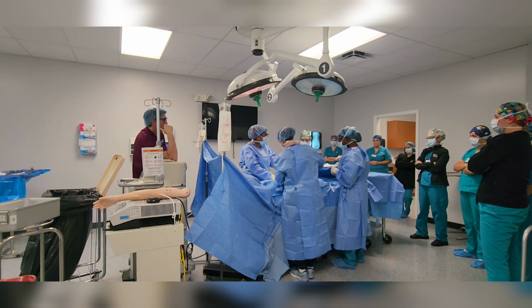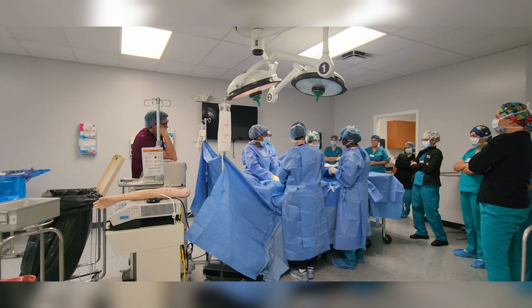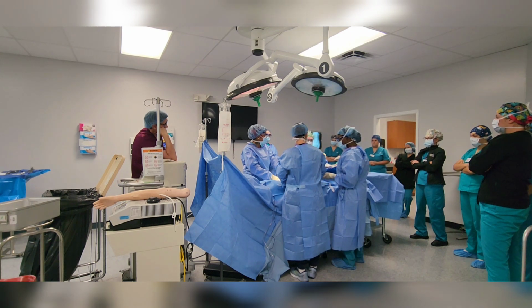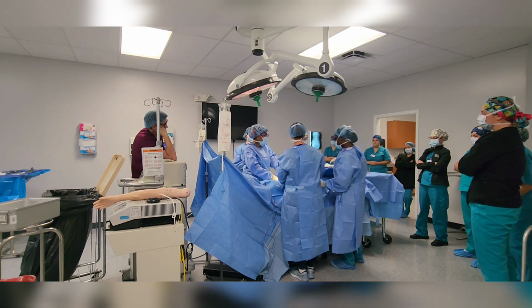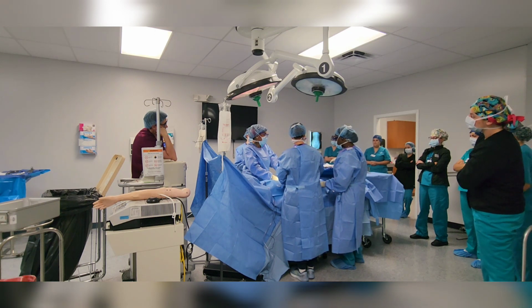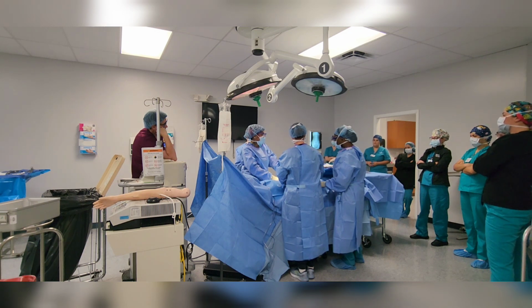Okay. Suture. Now I'm not a first assist, so don't laugh at me. What? Here, you can hold this one for me. I'm just asking for things. So how would you do that? Remember? Up. Hold it up. There. See, now you're going to place them into their hand that they're going to use. They're not going to have to adjust.